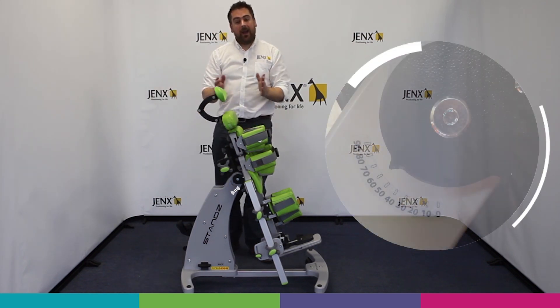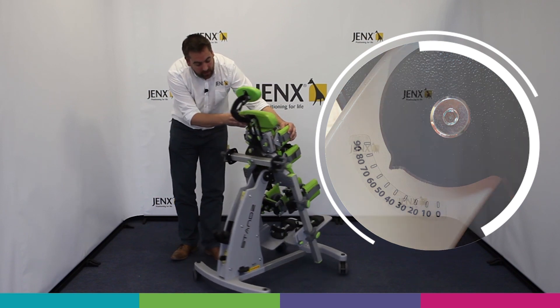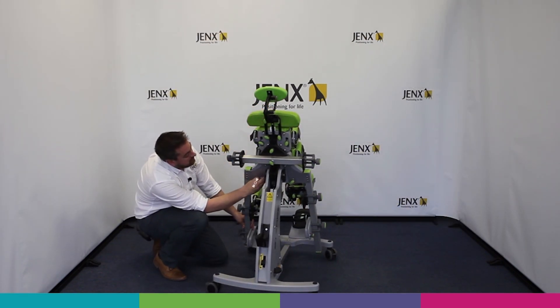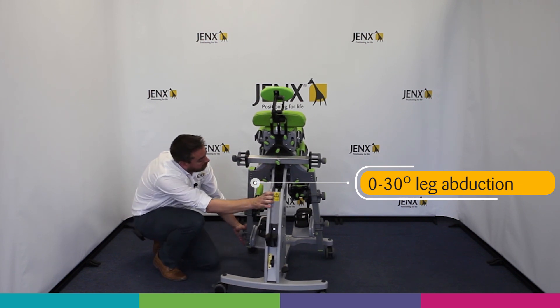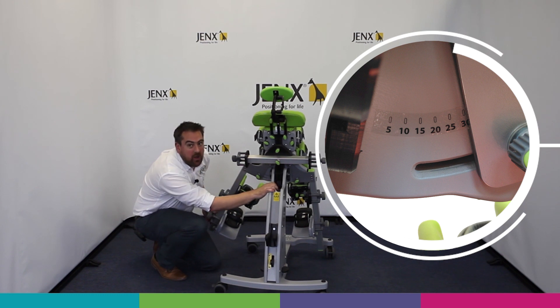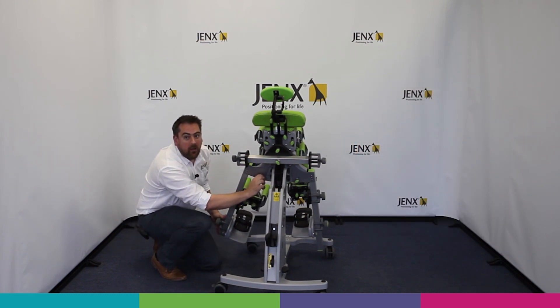Angle gauges located on either side allow us to see just what angle of standing we're at. For the leg abduction, which is 0 to 30 degrees, in a fluid motion we loosen the wing knob, open the leg, and we have another chart here for being able to record or identify what angle of leg abduction we're achieving for each child.